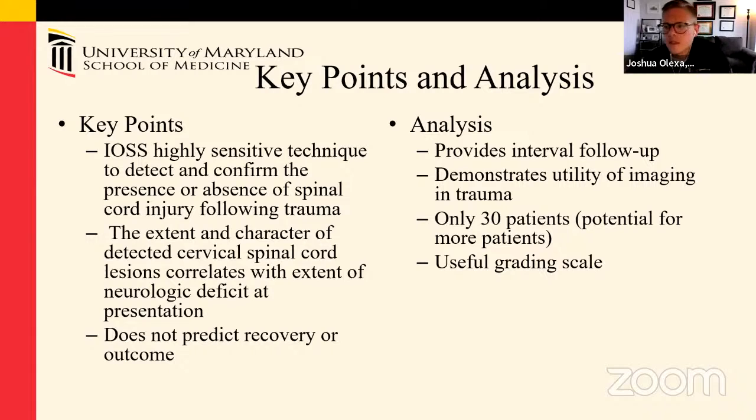That's a good question. They didn't specifically mention hematoma. They were really just talking about echogenicity and hyperintensity that they saw on a few that had MRI. But they didn't specifically talk about or specifically mention hematoma. At least from what I remember, yeah.